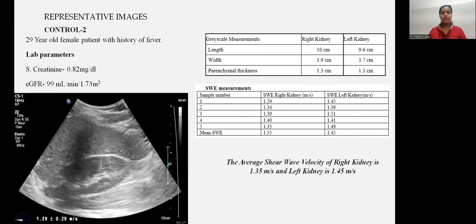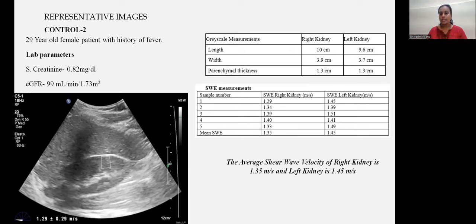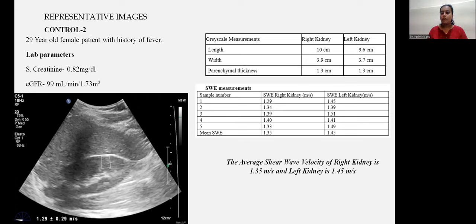Second control: a 29-year-old female with a history of fever. Serum creatinine 0.82 mg/dL, eGFR 99 ml/min/1.73 m². Right kidney: length 10 cm, width 3.9 cm, parenchymal thickness 1.3 cm. Left kidney: length 9.6 cm, width 3.7 cm, parenchymal thickness 1.3 cm. Average shear wave velocity was 1.35 m/s in the right kidney and 1.45 m/s in the left kidney.